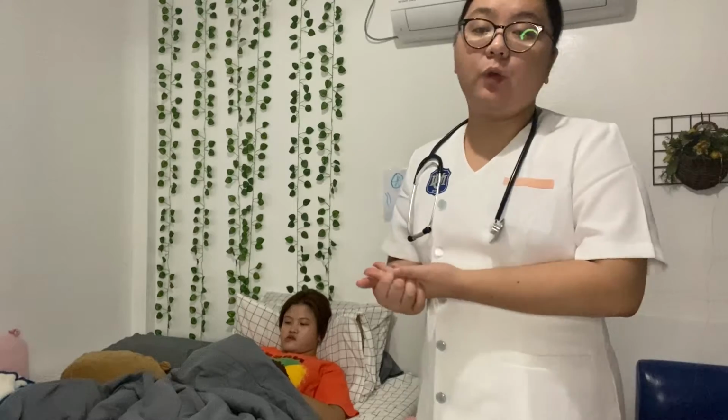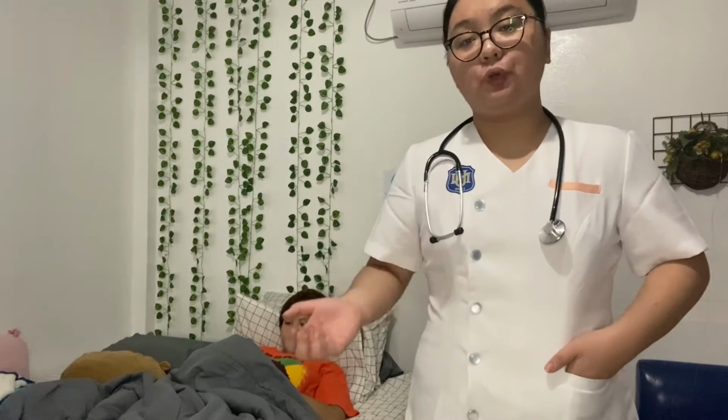And then after that, I need to assess the patient, of course, for safe and quality nursing care. Number one, assess the client for the presence of congestion in auscultation of the thorax, and note the client's inability or ability to remove the secretion through coughing. And also, the next step, I need to observe the vitals.